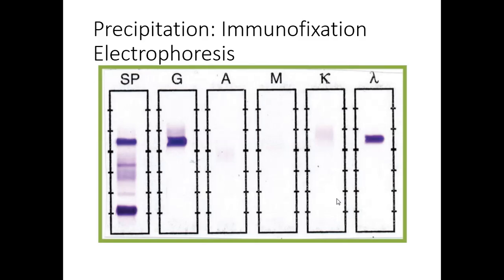So as I said, immunofixation electrophoresis is a double diffusion technique. First, we're going to apply the antigen to a well. This one doesn't have a positive and negative charge. It's probably going to be up here. So there'd be a well, a well, a well, a well, a well, and a well. And so we first do that, and then we let it go through the solution, and we're going to apply electrophoresis, and we're going to have it separate out.